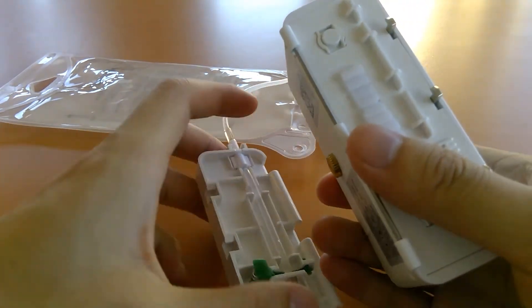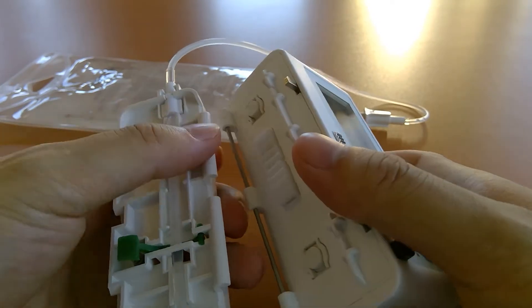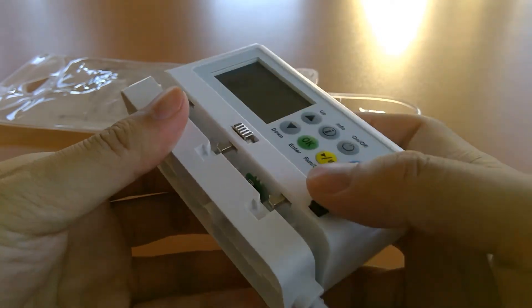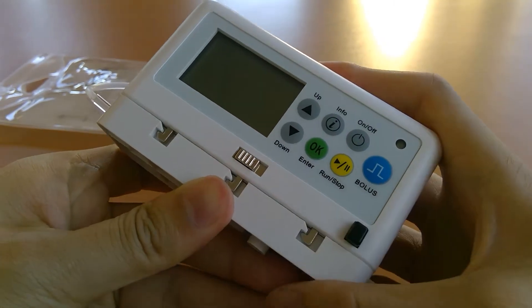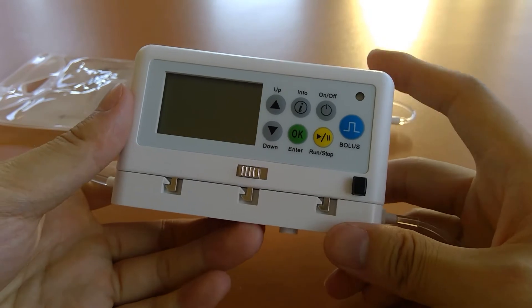To attach the cassette onto the pump, you see these two plastic hooks — you want to hook that onto the metal bar here. That creates a hinge, and when you bring it up you hold the black button down, which releases these three hooks. It should just click into place very easily, and from there you're ready to turn on the pump and use it.